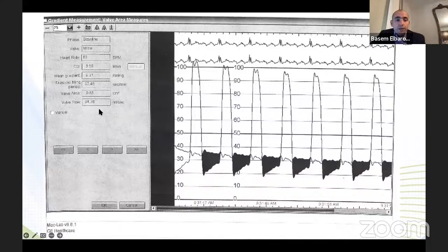Now, usually you can reach the diagnosis of severe mitral stenosis or severe aortic stenosis by non-invasive measurements. So I see Dr. Slake has commented that if you get good imaging and history, it might be of historical interest. However, we still see those cases where we're not 100% sure, but we think they have the disease, and we're going to be sending them for surgery.